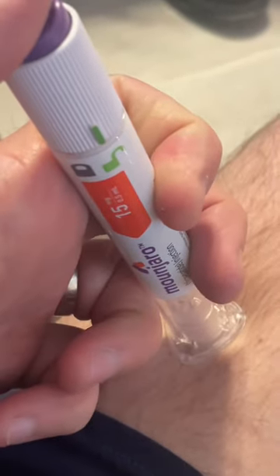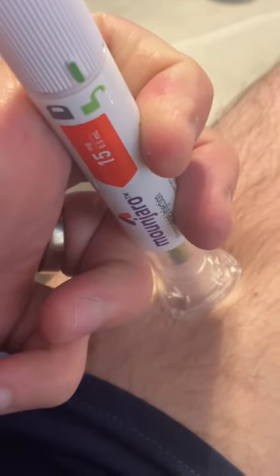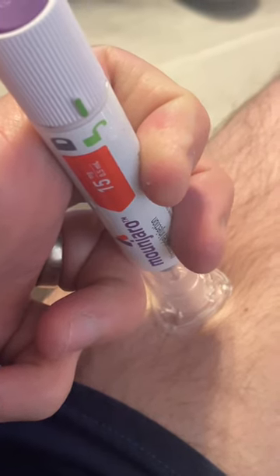I've already wiped my leg off, so you're going to wipe that area off with alcohol. You're going to push the button, and once you push it you'll hear two clicks. Then you're going to wait six seconds. And that's it guys — super easy.